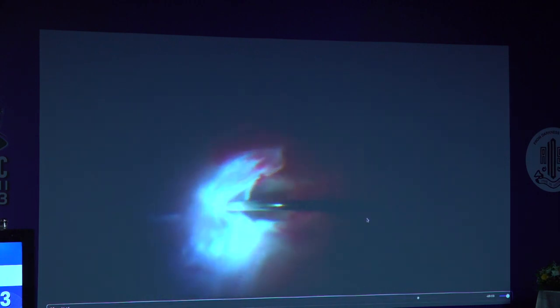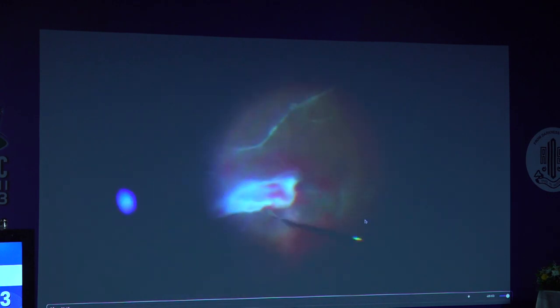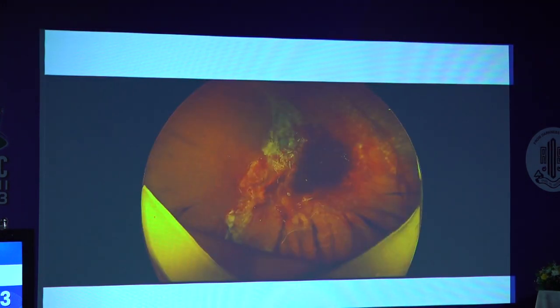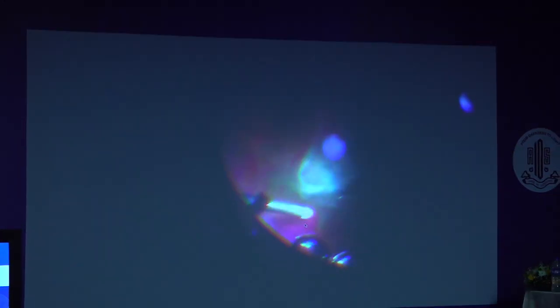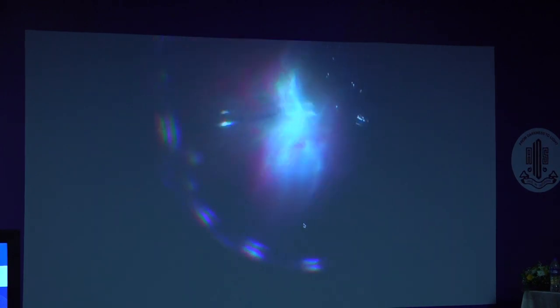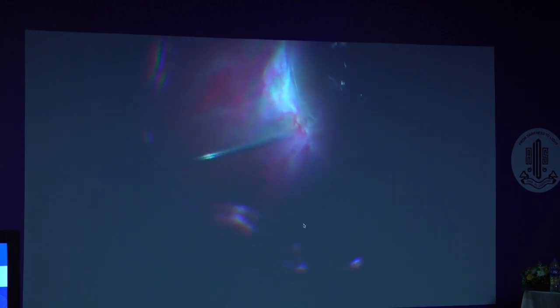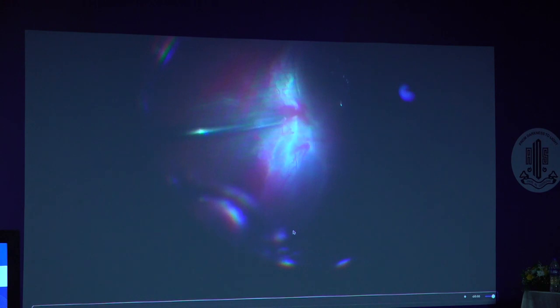In this way, when there are no anatomical landmarks or macula, we guess the way the disc is and then start the search. This is a post-operative appearance where a relaxing retinectomy is required. This is released, and again we have to cut this membrane into pieces so that the handling and dissection becomes easier. So this spatula is being used to make way, and then the membranes are cut, and then these two membranes again will require bimanual surgery.